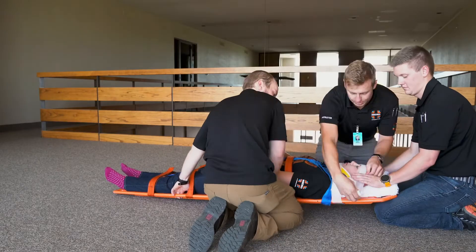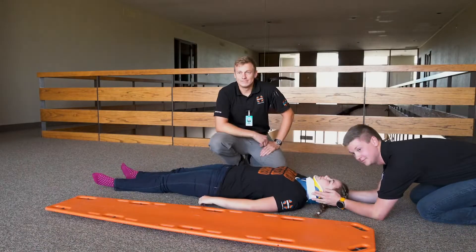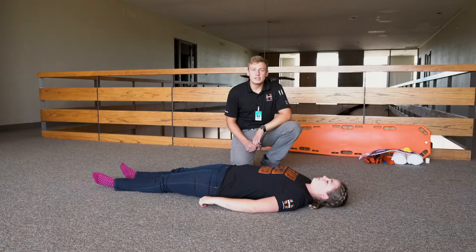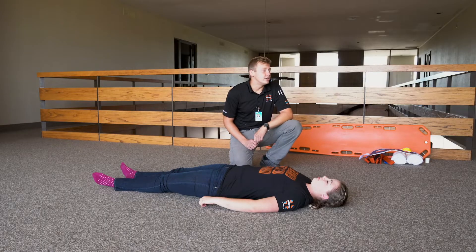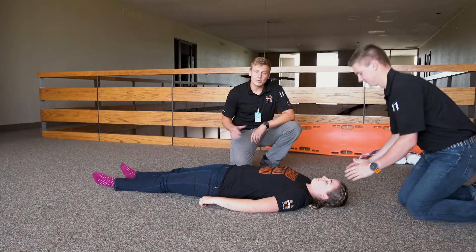Now we'll give you a demonstration of the whole process. After taking appropriate body substance isolation precautions and determining your scene is safe, direct your assistant to place the patient's head in a neutral in-line position and maintain manual stabilization throughout the process of backboarding.